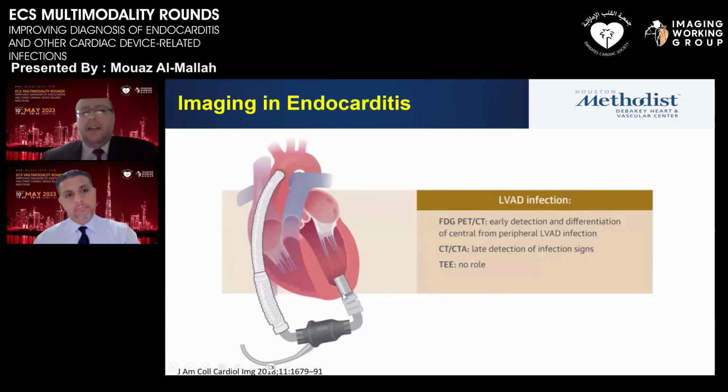And finally, for LVAD, this is probably the tool where FDG PET has a huge role compared to transesophageal echo and others, given the amount of blooming artifact and all the device-related artifact, but also the complications that will need further assessment for infection.